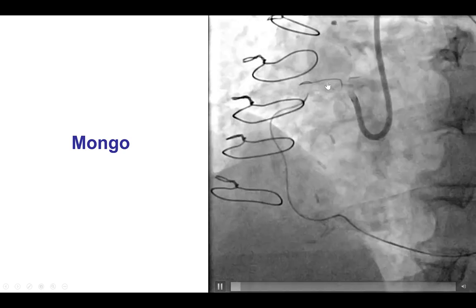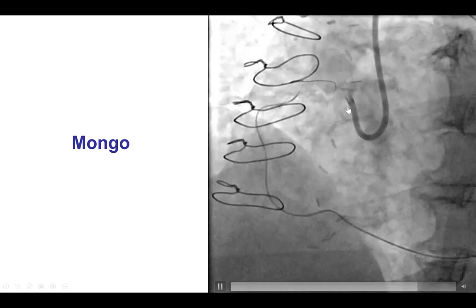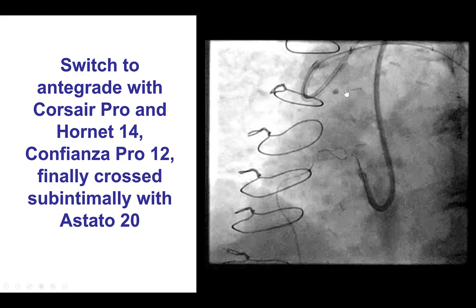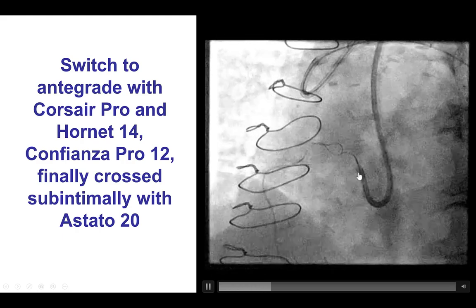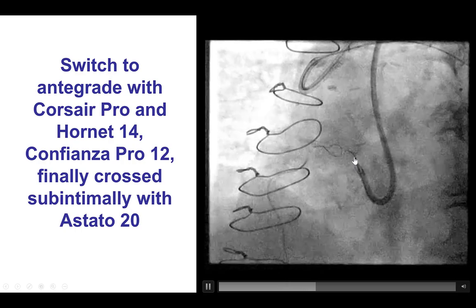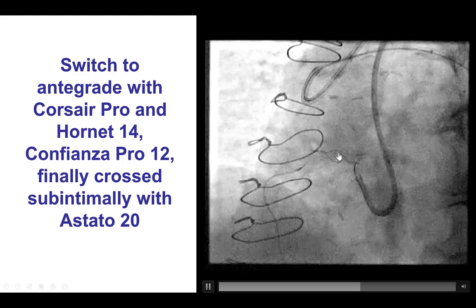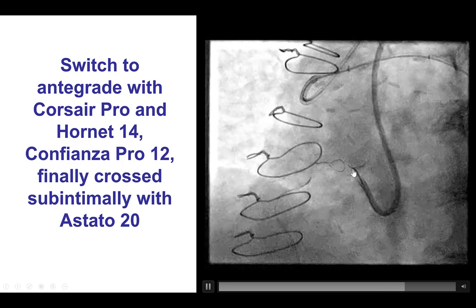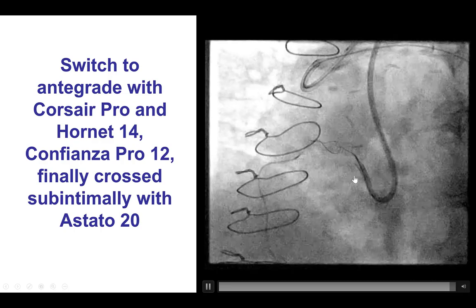Now that we had a retrograde demarcation of the location of the right coronary artery, we did some additional antegrade injections using an AL-1 guide, and we could now see some possible entry into the RCA. We used various guidewires and eventually using an Astato 20, we were able to advance it subintimally inside the structure of the proximal right coronary artery. It was heavily calcified, but the guidewire eventually made good progress using the retrograde guidewire as a marker.